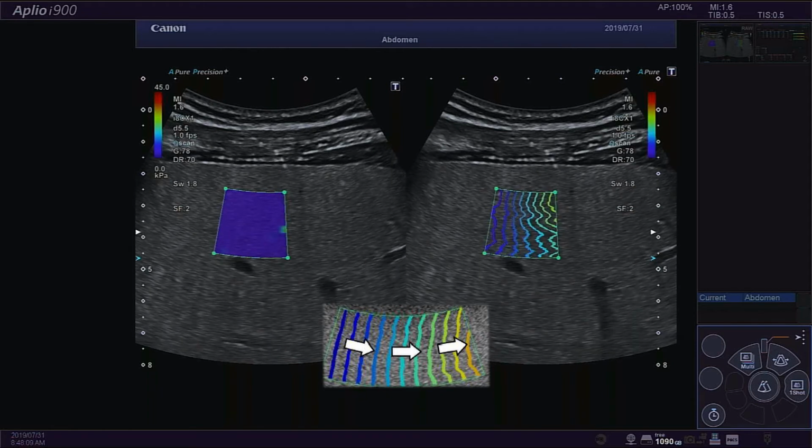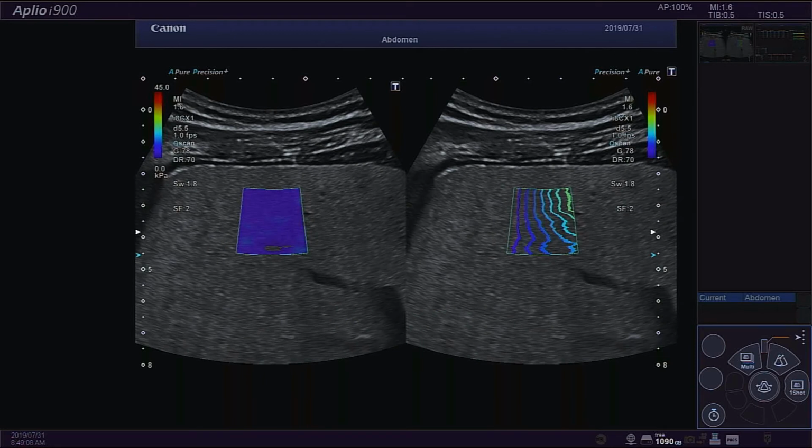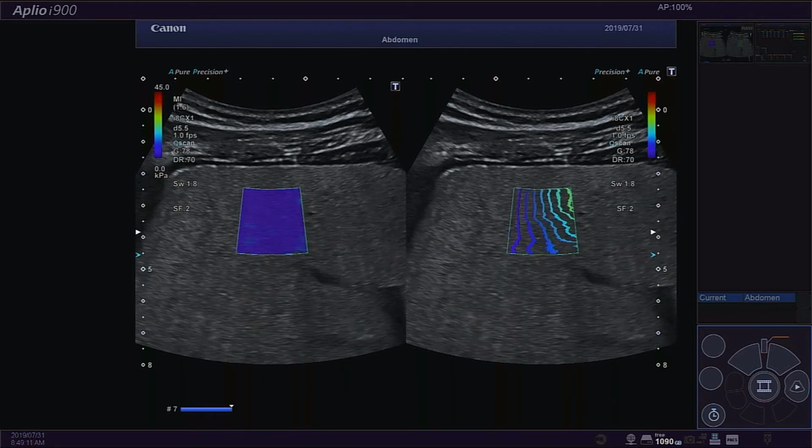If you can see some irregularities in the profile, you must not use these areas to perform a measurement. This propagation mode is therefore an essential quality criteria that also helps physicians to select when to freeze the image and select the best location to place a ROI measurement.